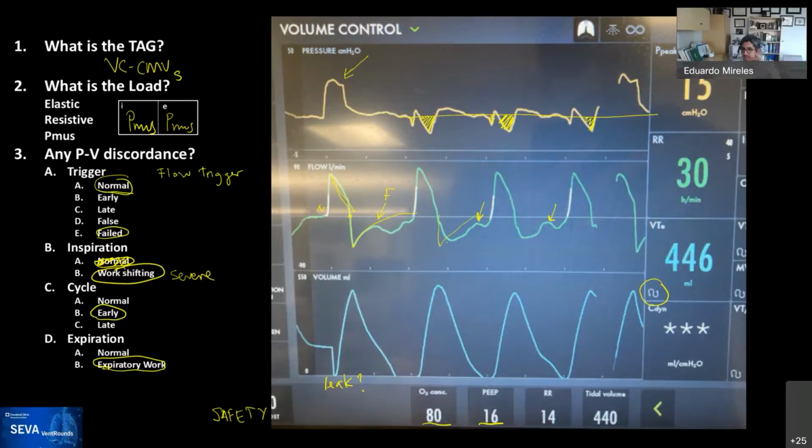So I have two people asking to change to NAVA, so pressure control CSVR. Some people said change to pressure control or adaptive instead of set point. So I guess adaptive would take them at least to baseline pressure, but it would not be fighting the ventilator. So it would be a way to keep them with the least amount of tidal volume possible. All right. Okay.